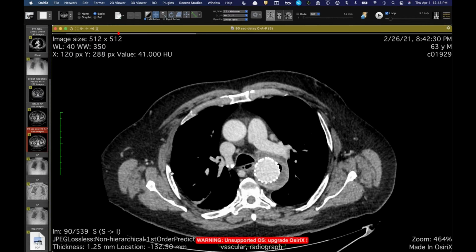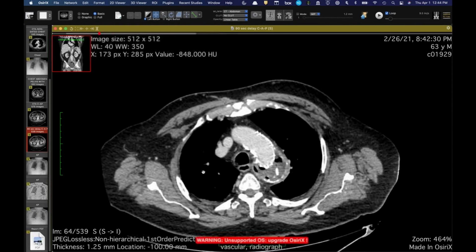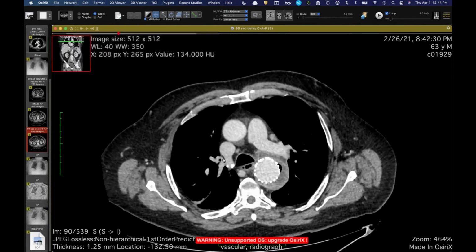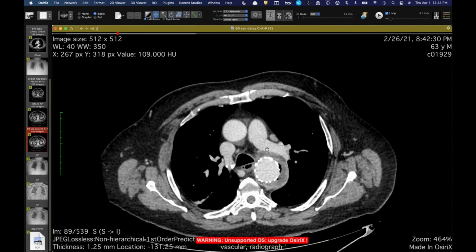Got it. Yeah, we do a lot of CT esophagrams here too. I was a little skeptical at first, but you're right. That article does show that it's reasonably adequate. So yeah, I don't know. But in this case, it was mostly just the radiographic finding, because obviously we don't have resolution or a final answer in this case.